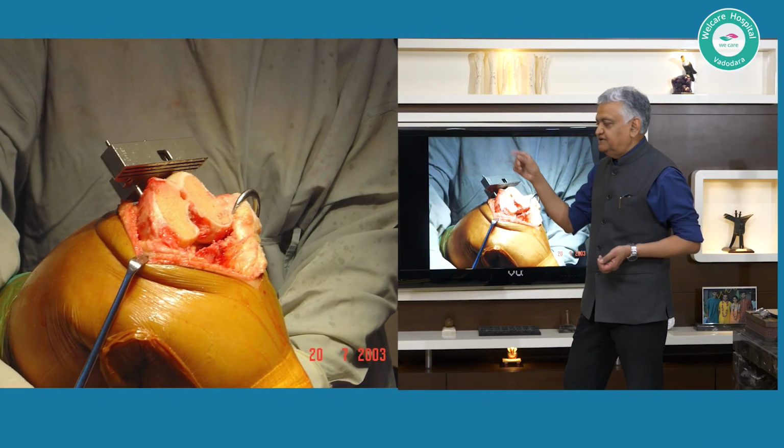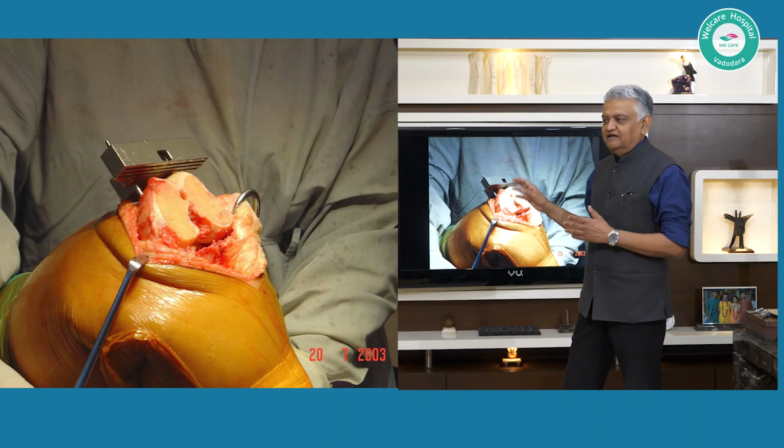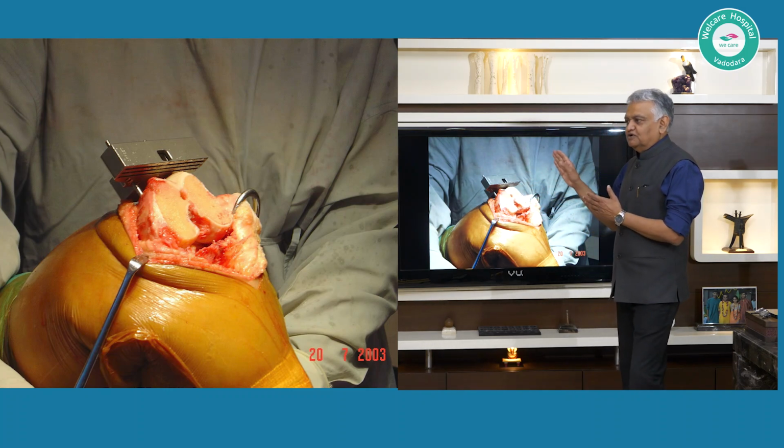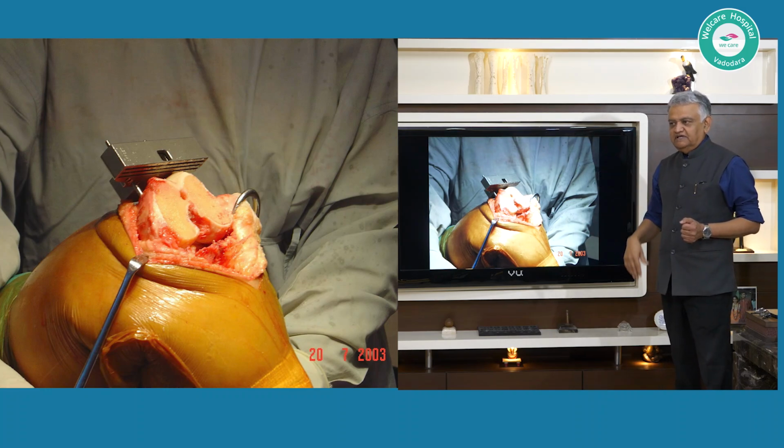Those basic instruments that he has are part of his body extensions, and that is why he is able to do this joinery the way he does, without any navigation or robotics, and again, sometimes in much tougher material than what we have. We have only one consistency, and that's bone.